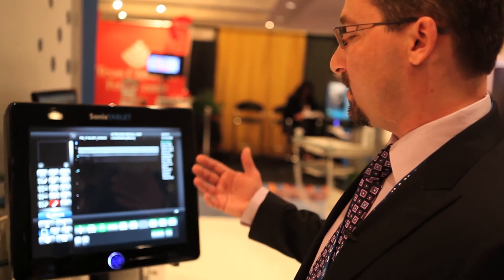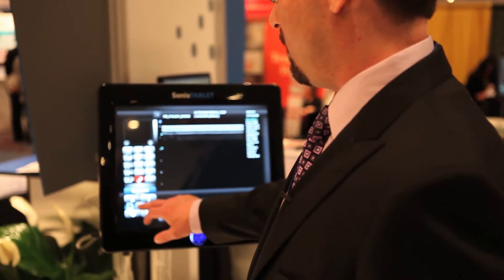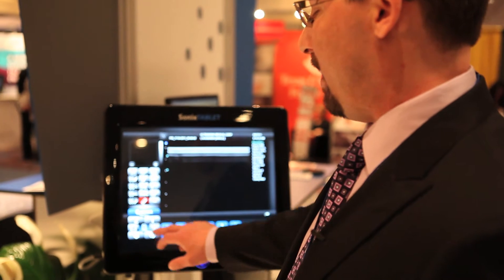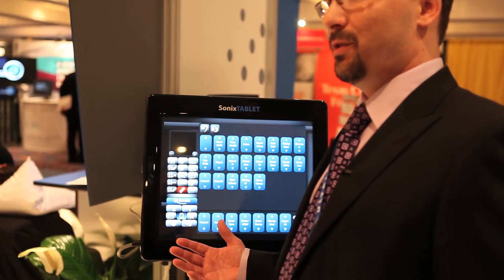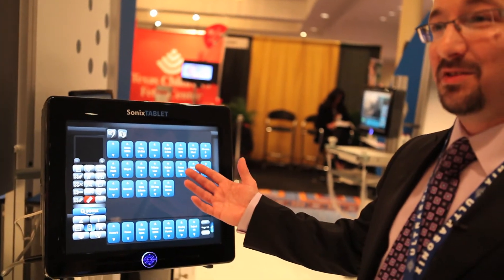Once you hit start you get right into your imaging mode. We've got three menu options: our imaging modes — for example B mode, color, pulse wave, etc. — our imaging adjustment controls menu, and then our favorites menu, which is basically a hybrid combining both. Our tagline as a company is 'ultrasound your way,' and nothing speaks better to that than this screen.